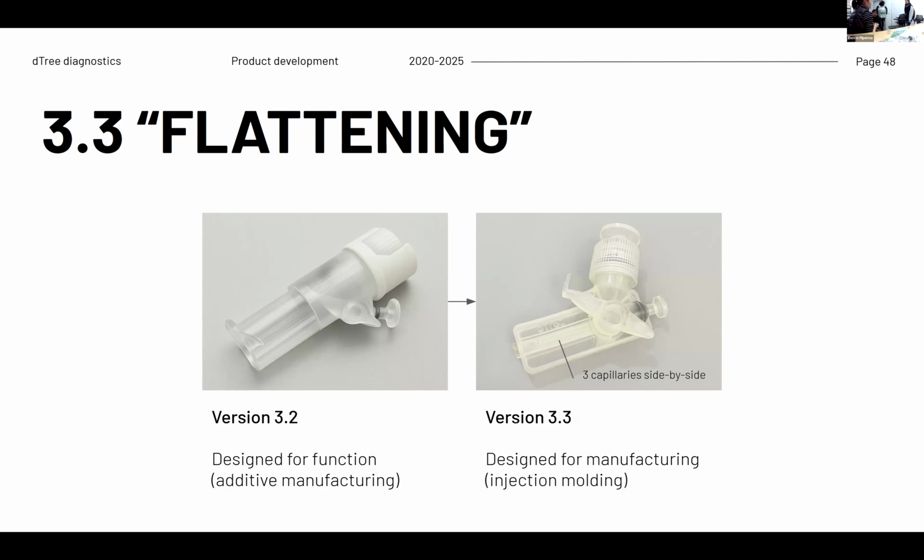Other stress tests include heat. You put it in boiling water, and that's something that we also test. They did a lot of that stress testing for us, and they made sure that the dimensions are still the same, close to 95.